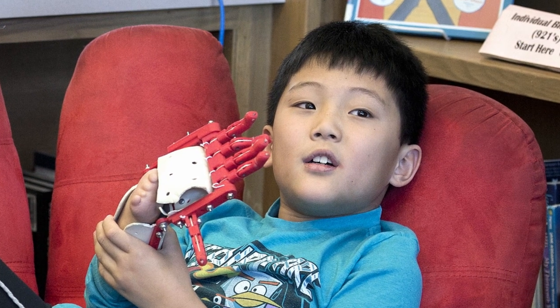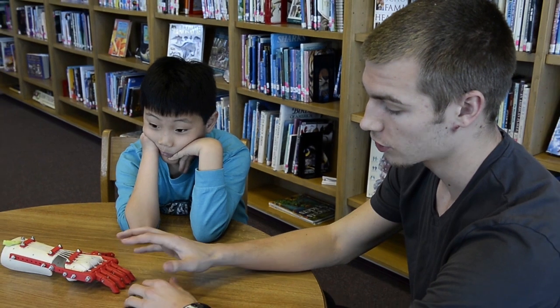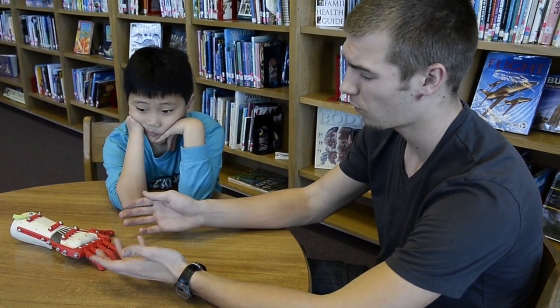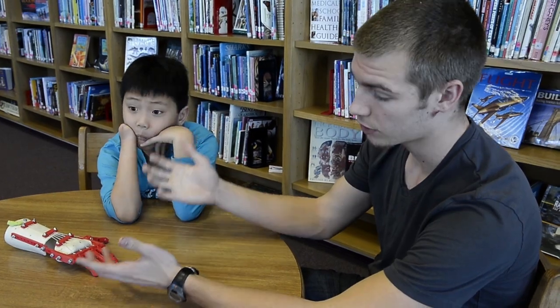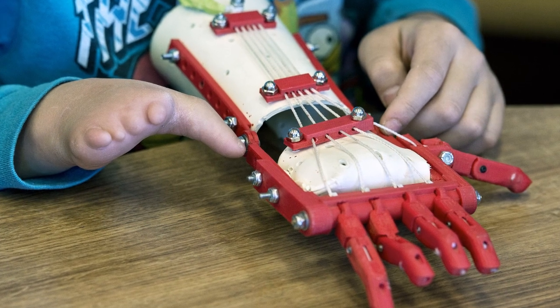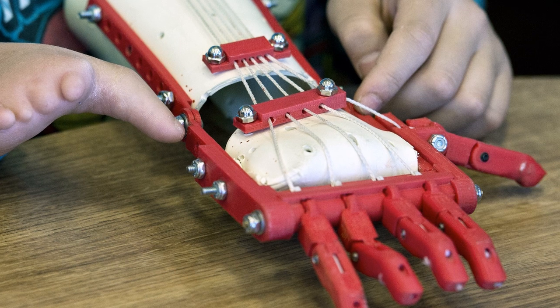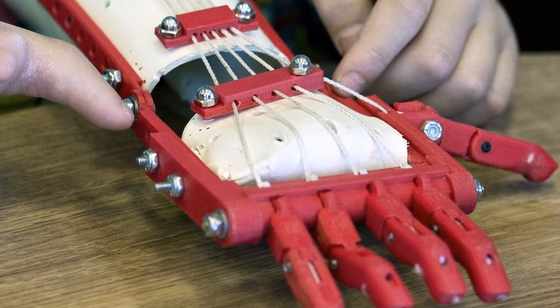MakerBot has a program called MakerWare, which you can open and somewhat edit the files. So I took the original file, imported it into that program, looked at it, and realized that it had, I think, a 4 or 5 inch gap in between this area, and his hand was only 3. So I downscaled it, made sure all the fingers were still a good length. That was a little bit of maneuvering around the program to make it fit his hand specifically. And the nice thing about that is, if he outgrows this one, we can just print out a bigger one.